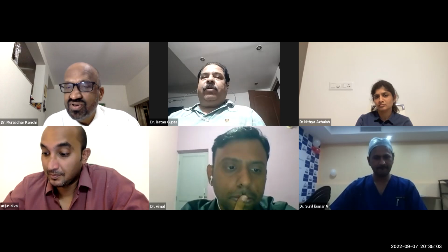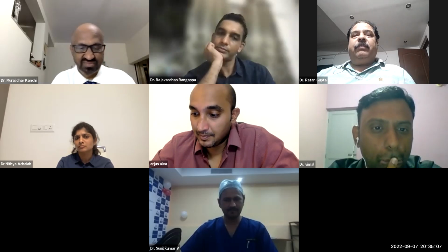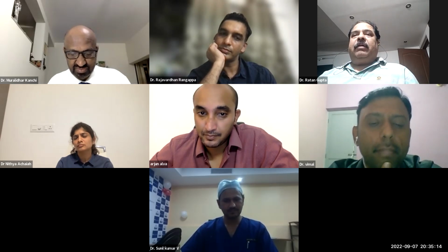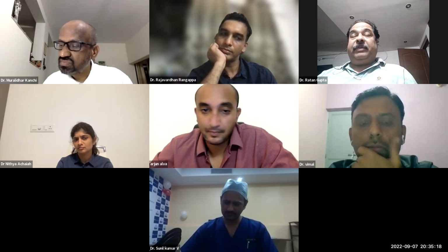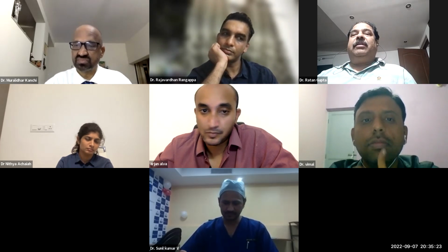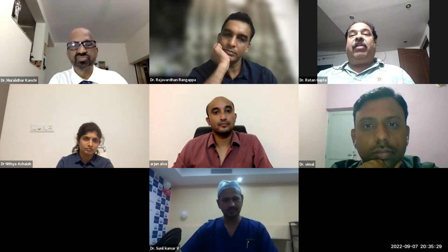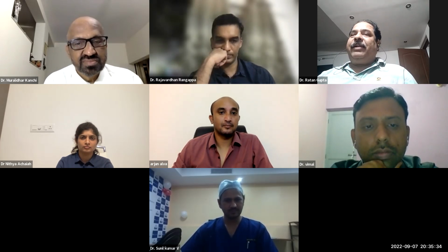One more point I wanted to debate or discuss was the role of echo during ECMO, maybe it's VA ECMO or VV ECMO. I think there is a significant role for it to play, especially looking at post-operative patients. If it is a VA ECMO, you can look at the pericardial collections, pleural collections, and the IVC. You can see the cannula placement. What do you have to say, Sunil? Can you elaborate on this?